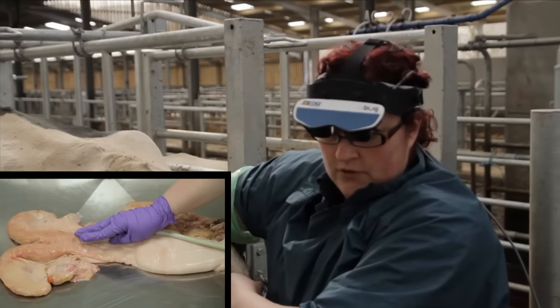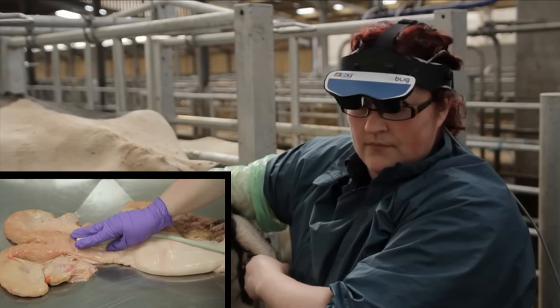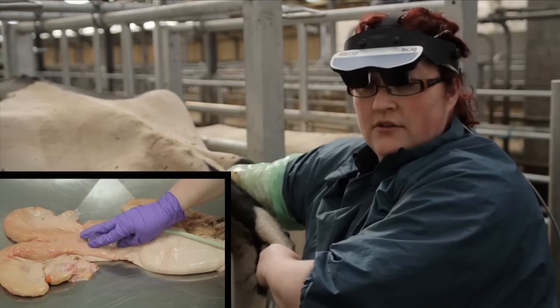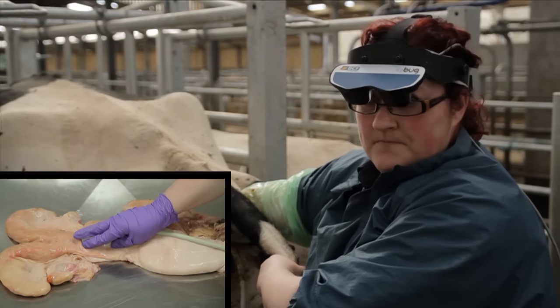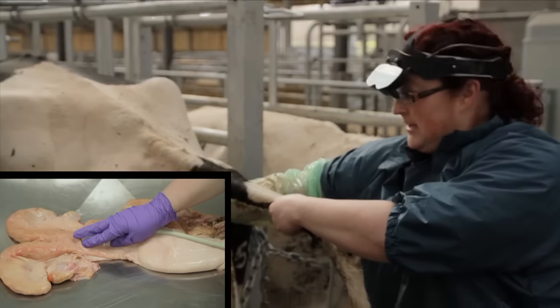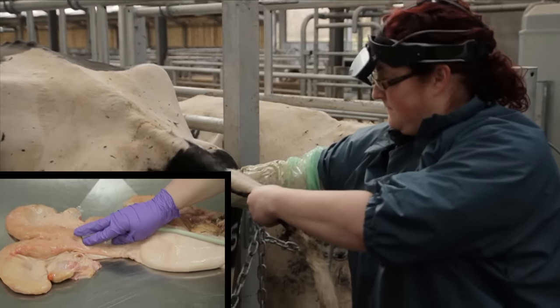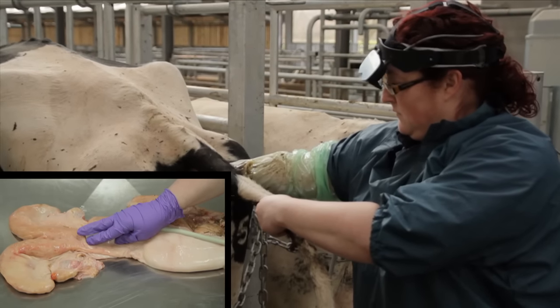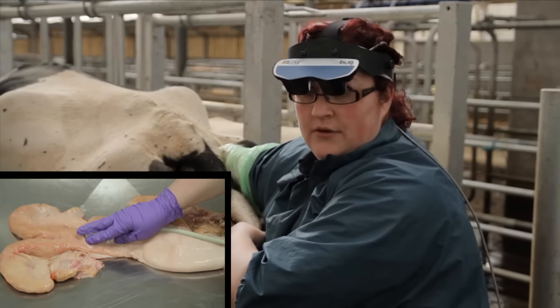We'll again come to the cervical region. We can retract the uterus into the pelvic canal if need be — we don't need to do that in this particular cow. If they begin to strain, just allow it to pass until they relax, and then gently proceed inwards.